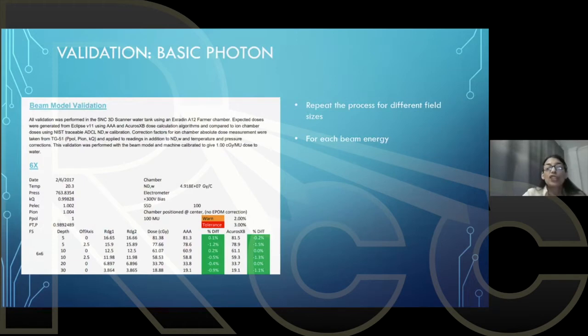So you make sure that when you encounter a problem, it's because you are introducing a new parameter. It's not because you have all the parameters at once. Otherwise, it's going to be very, very challenging for you to discover where the error is coming from.